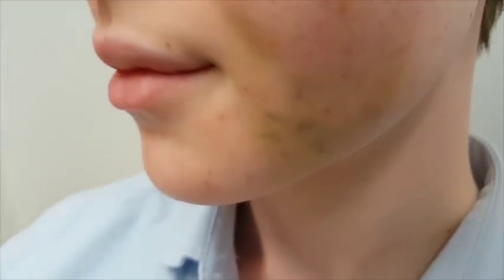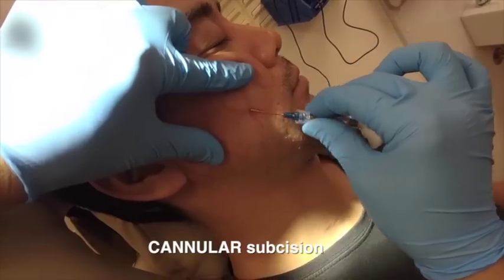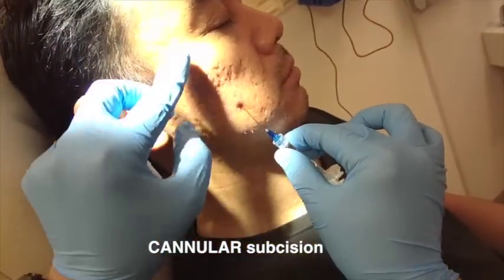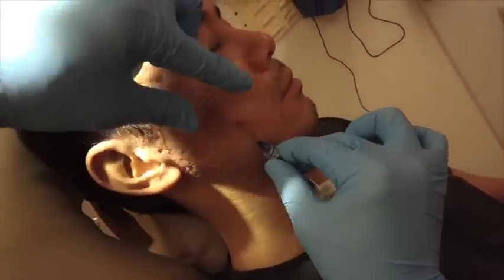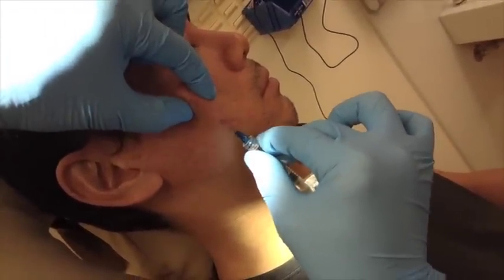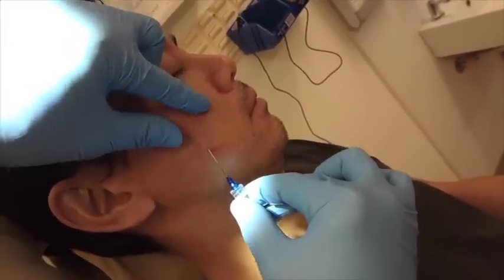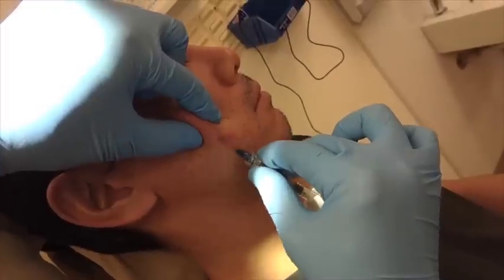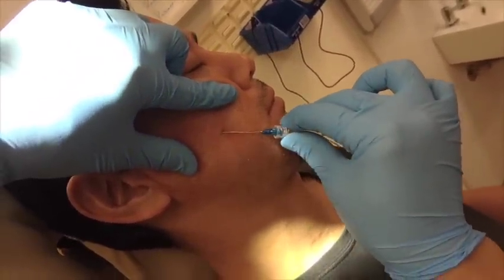Bruising is very common and hematomas as well with no-core. Over the last three years I've been using cannula subcision. A lot of dermatologists who have been using subcision find cannula subcision is probably better than no-core, and it's been confirmed by recent papers this year. It is about seven times less likely to cause hematoma together with seroma formation.